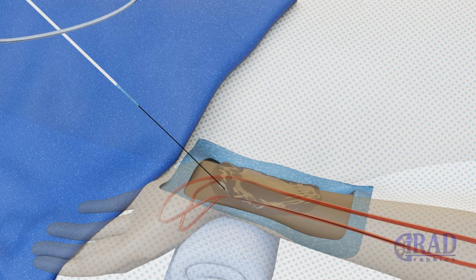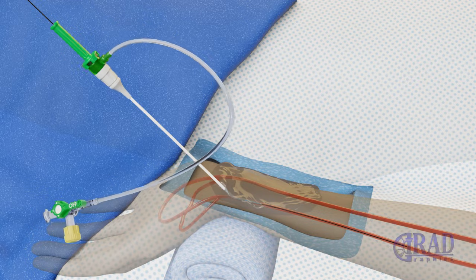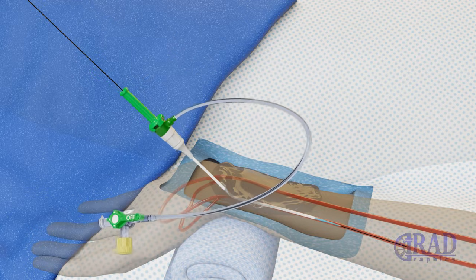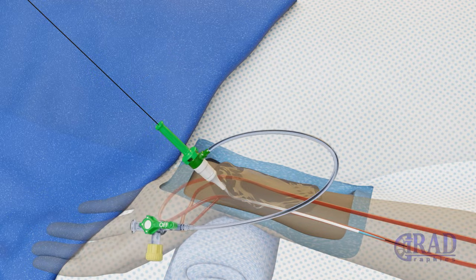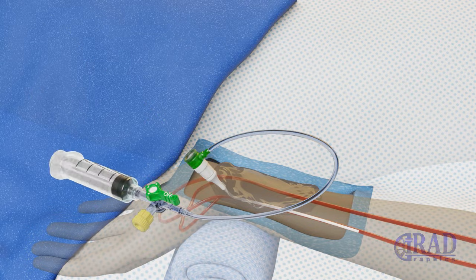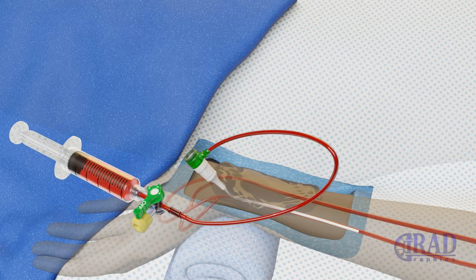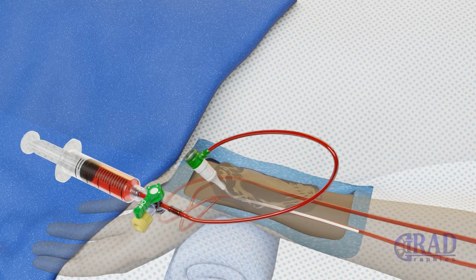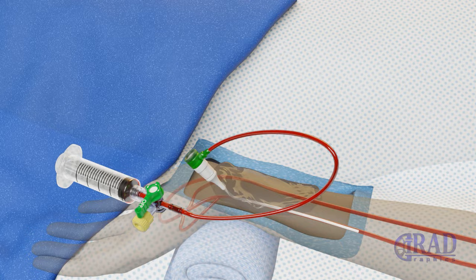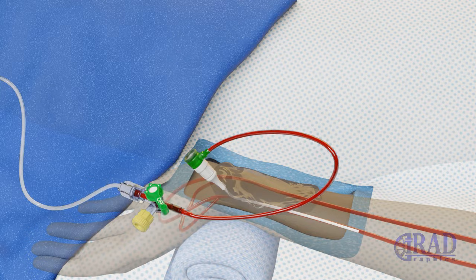Once the sheath is advanced over the microwire and properly placed within the left radial artery, the microwire and inner dilator are removed. A mixture of vasodilators is injected through the sheath to avoid arterial spasm. Then normal saline infusion is started through the sheath to avoid possible clot formation.